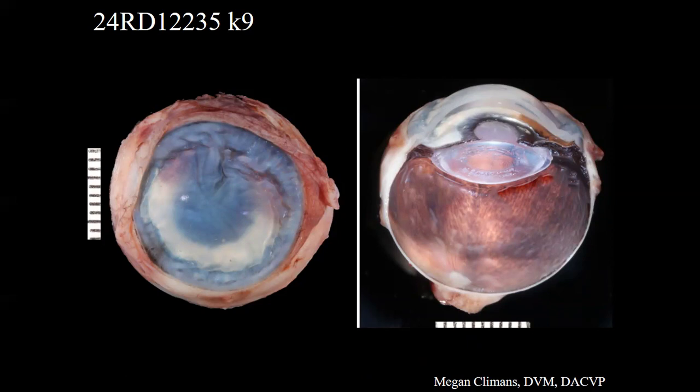So this patient was enucleated for a history of chronic anterior uveitis. It was just uveitis in this case, so no surprises on the histology. The patient had ocular hypertension documented, but glaucoma wasn't confirmed. The patient has heterochromia iridis and a progressive thickening of, in particular, the dorsotemporal pigmented part of the iris, which is a very interesting piece of history for this case.